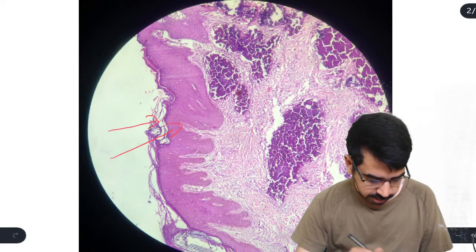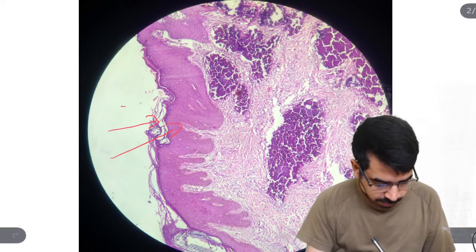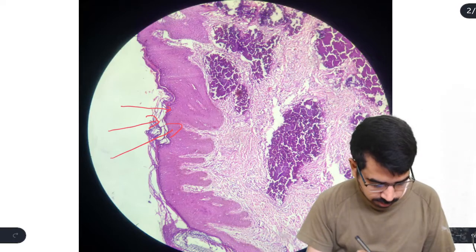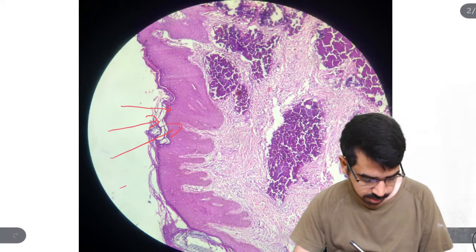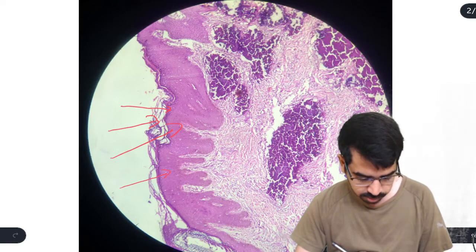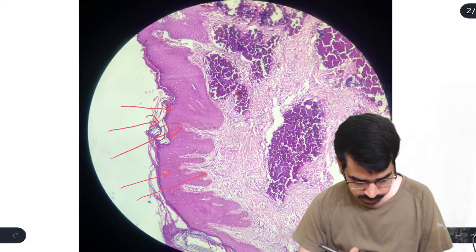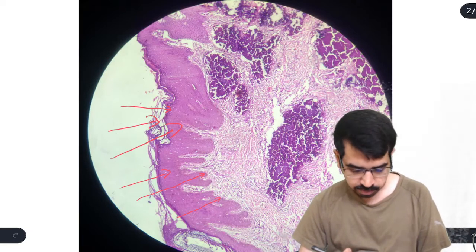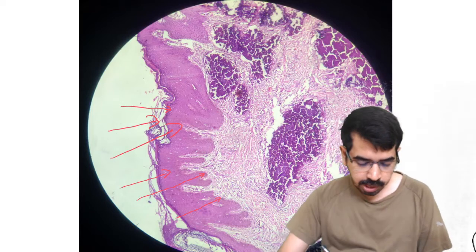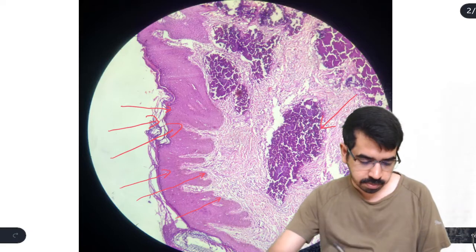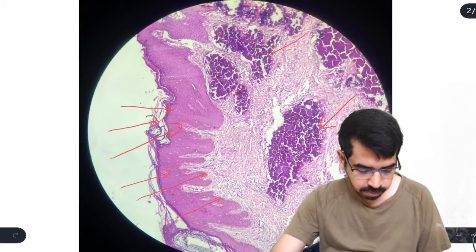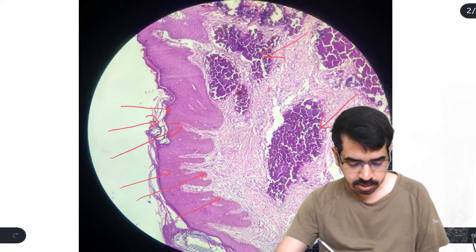Here we can see the stratum corneum layer, and here the stratum granulosum containing keratohyalin granules, and stratum spinosum, and finally the basal layer of cells — stratum basalis. The dermis shows these basophilic deposits, these deposits of basophilic material in the dermis.